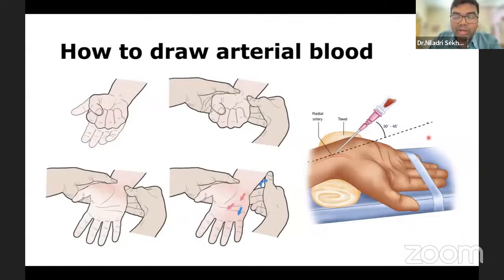And how will you take blood from this wrist, from the radial artery? You have to extend it by putting a little bit of gauze piece or maybe one NS bottle, and you can just try to fix the other fingers by using a strapping.